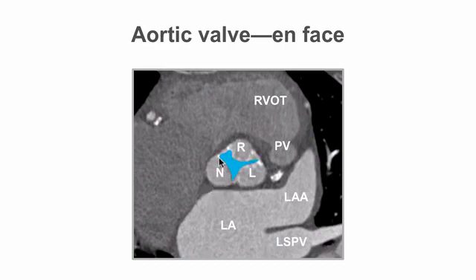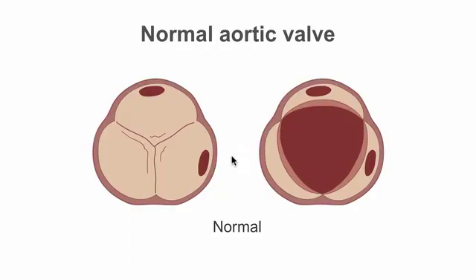This is the opening orifice area of the aortic valve, taken in mid-systole, and it shows a reduction in the opening orifice area. By tracing around this area, we would be able to obtain the geometric orifice area to determine whether or not the aortic valve was stenosed.